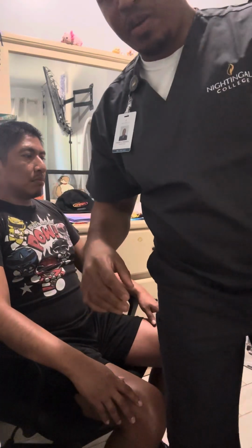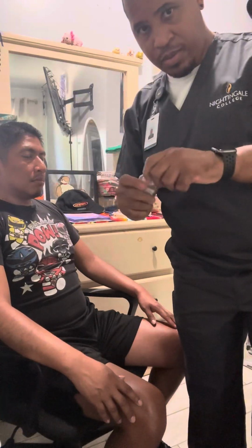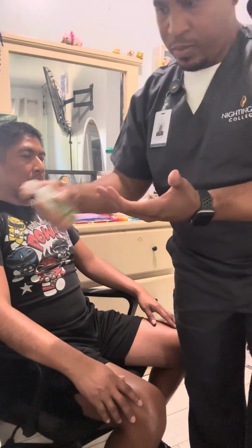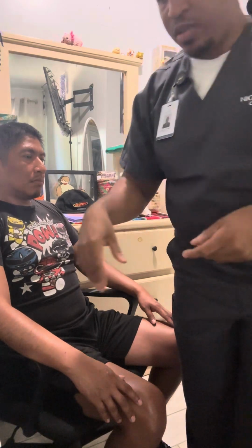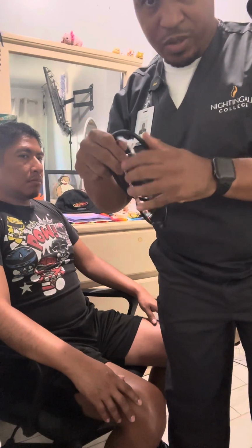So I'm going to start by using the hand sanitizer, washing my hands. I'm going to disinfect my stethoscope, the earpieces.